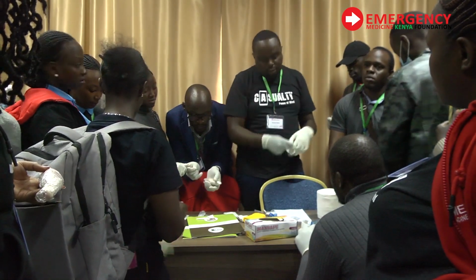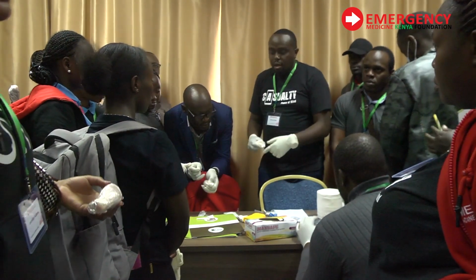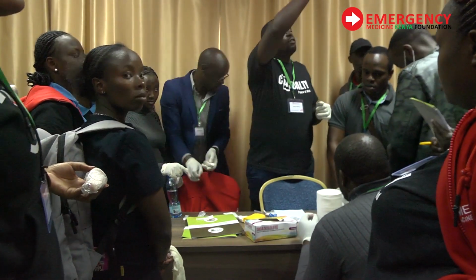Are we together? Yeah. Right. So let's do the attempt. Gloves. There is a box of gloves somewhere. There is a box of gloves on there.